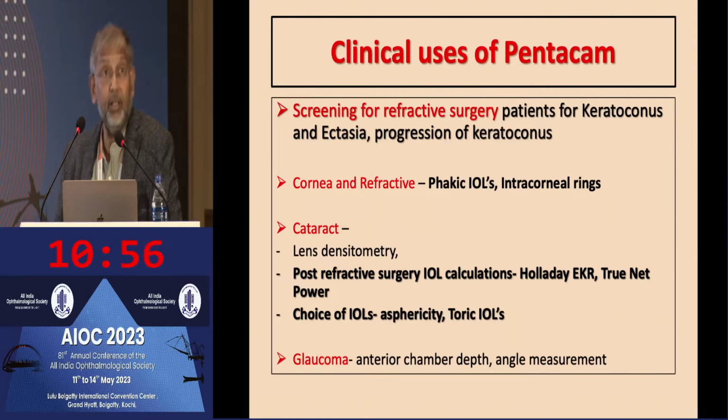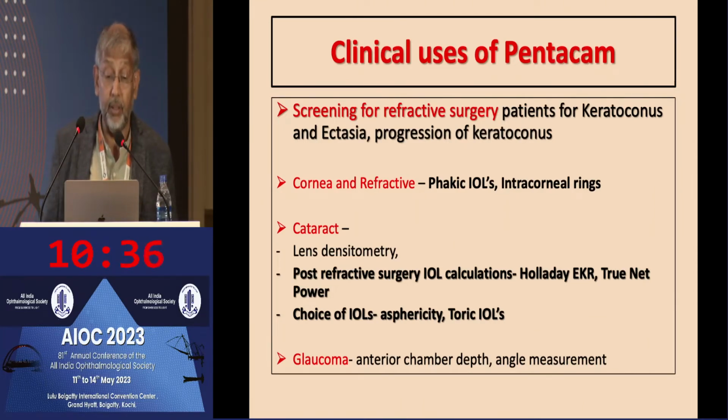Basically, it has been in use for screening for refractive surgery to rule out keratoconus or ectasia or progression of keratoconus. And of course, it has also been in use for cornea and refractive surgery in terms of phakic IOL and intrastromal corneal rings.